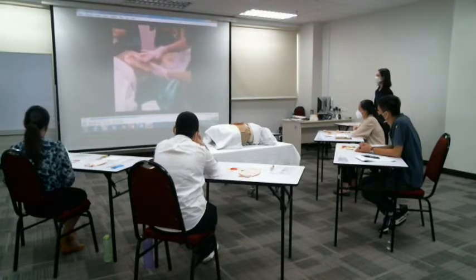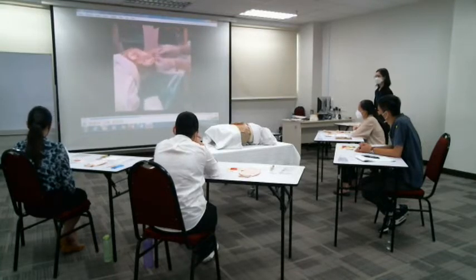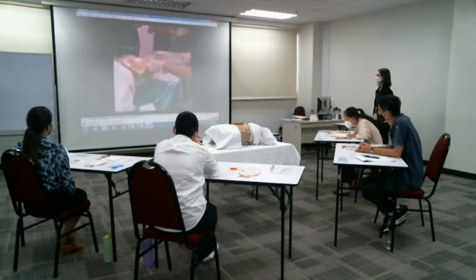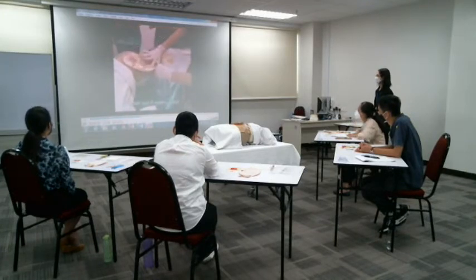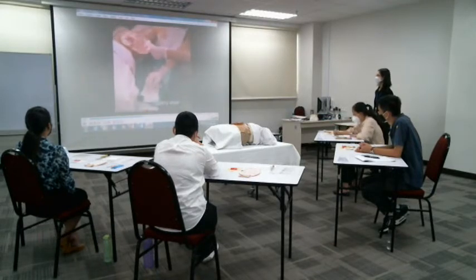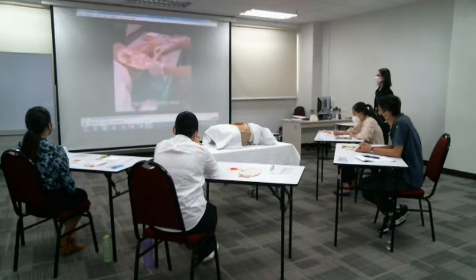Let's say this is a watery stoma. Okay, so open this. Here and then, at the end of the day, use the traditional way here.